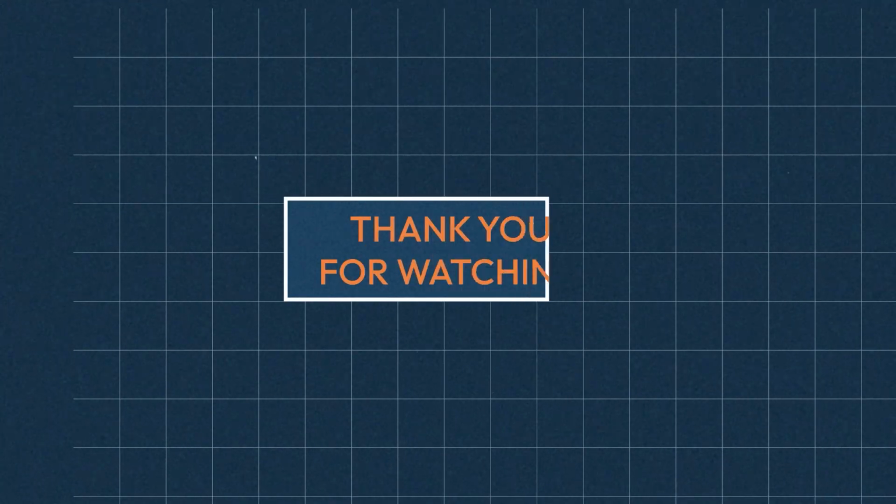So that concludes the section on practical applications to local regional disease for use of PSMA PET in radiotherapy.